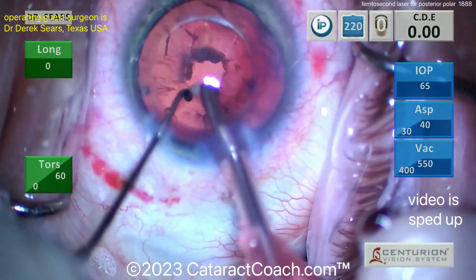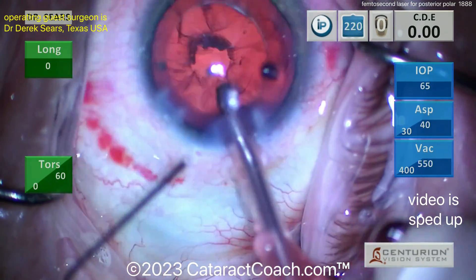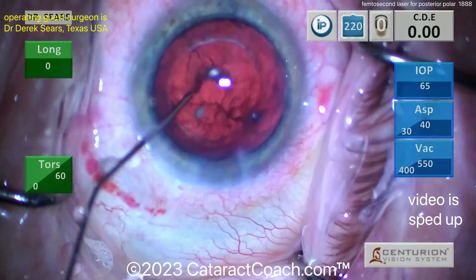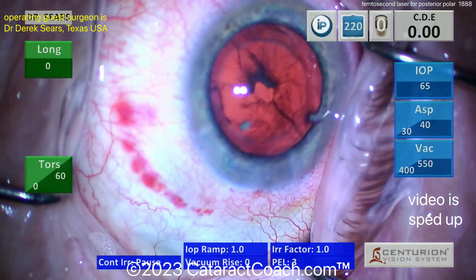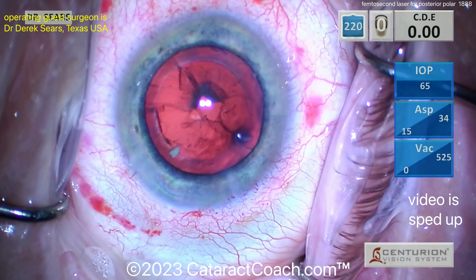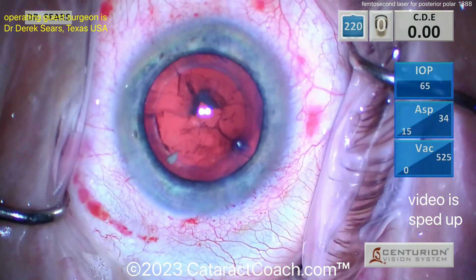Chopper comes out, probe still in the eye in position one — good, good, good. Viscoelastic here you go, beautiful — fill. Position zero on the probe and pull that out of the eye, very nicely done. Now switching over to cortex removal.